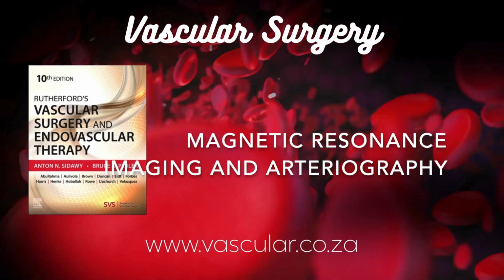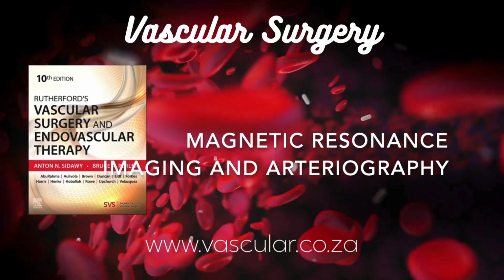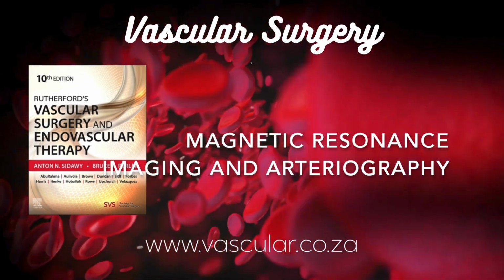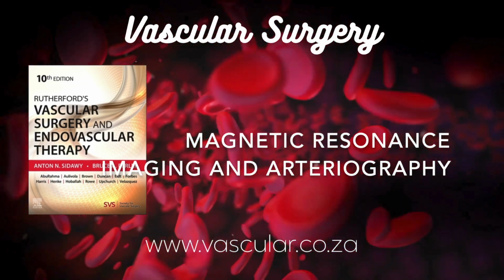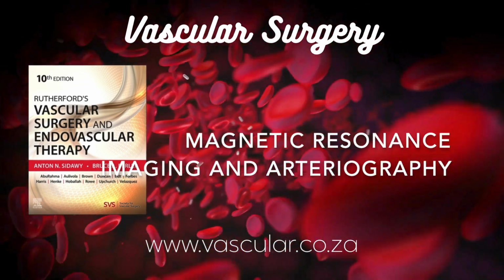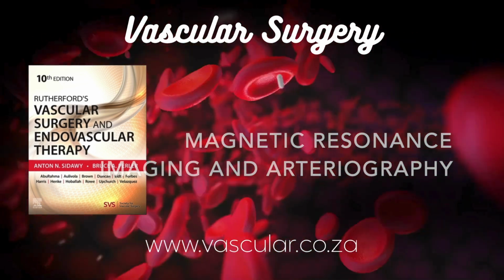Amazing potential. Okay, as we wrap up, let's briefly revisit that comparison. MRA versus CTA. They're often the main choices, right? Key differences. They are. Big difference is speed. CTA is generally much faster. Whole aorta in seconds. Peripheral runoff under 10 seconds sometimes. Wow. MRA takes longer, often 30 minutes or more on the table.